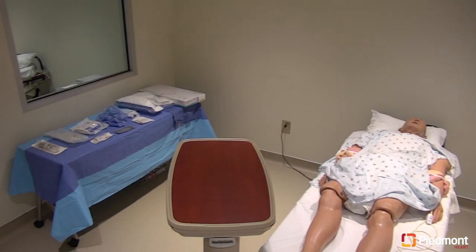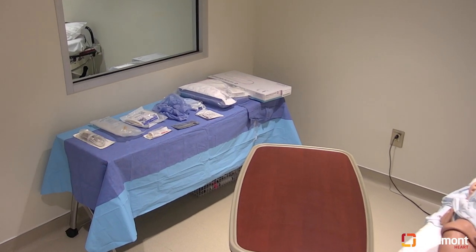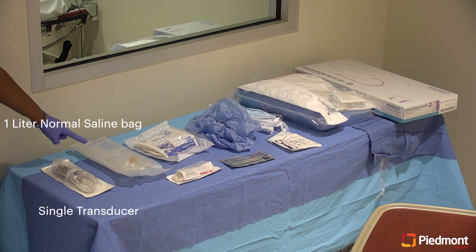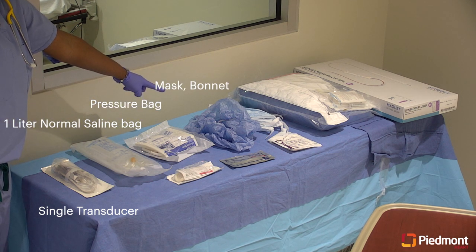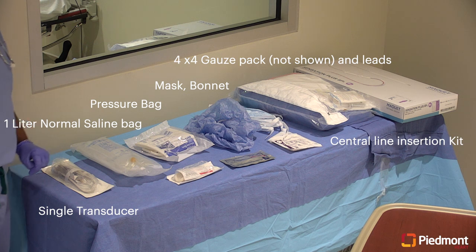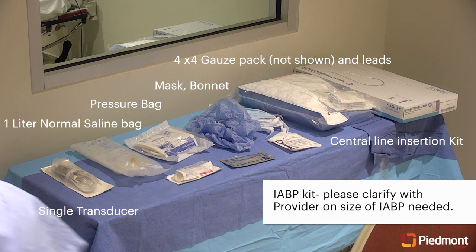Some units have a cart with balloon pump insertion supplies, but for the units who do not, please ensure you gather everything necessary. You will need a single transducer, saline, pressure bag, mask, bonnet, gauze, leads, a central line insertion kit, sterile gloves, and a balloon pump kit.